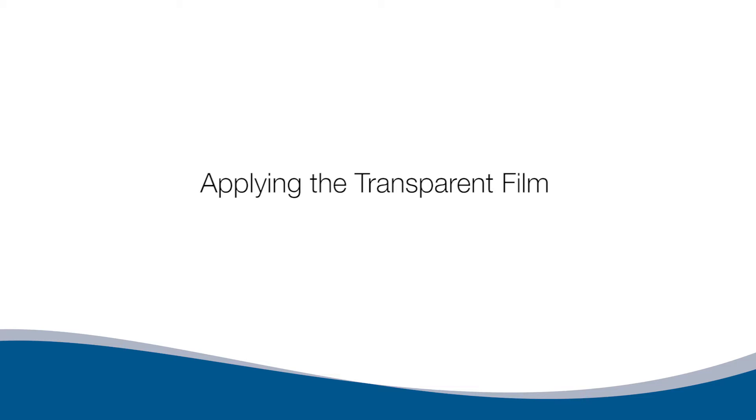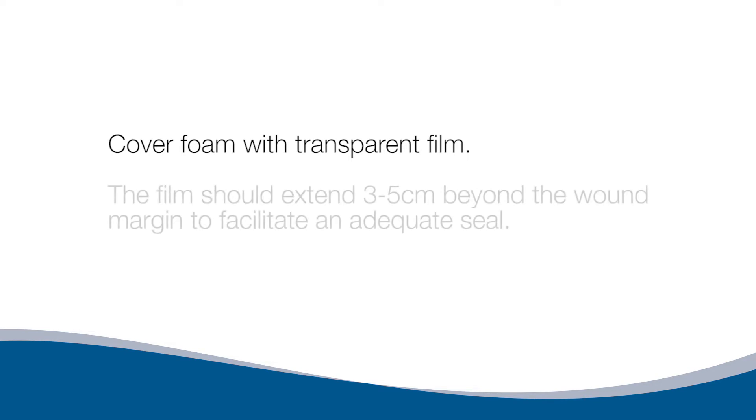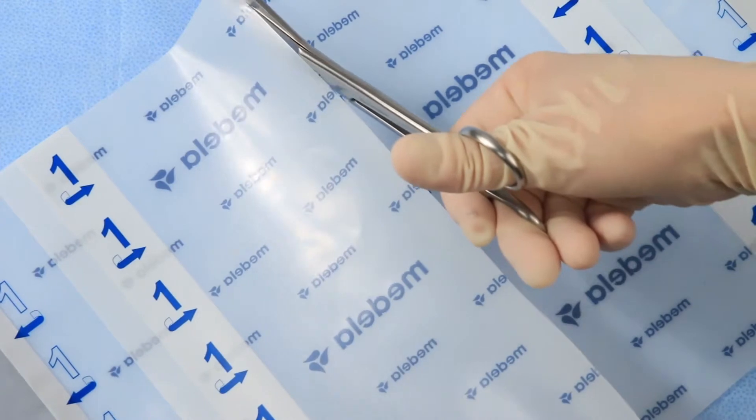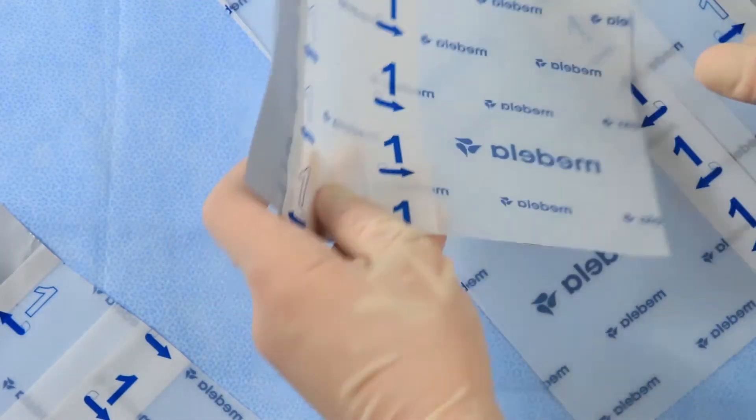Applying the transparent film. Cover foam with transparent film. The film should extend three to five centimeters beyond the wound margin to facilitate an adequate seal. The transparent film can be cut into multiple pieces for easier handling.